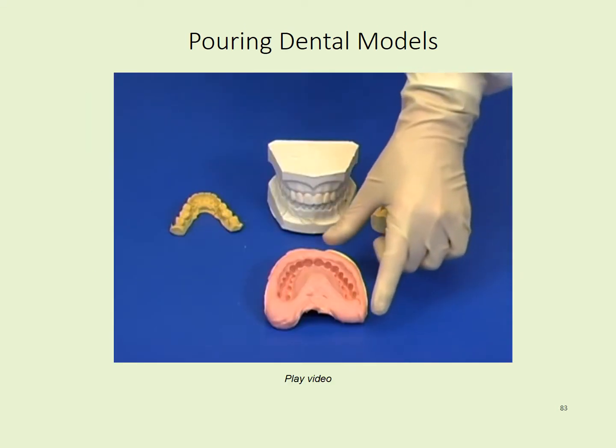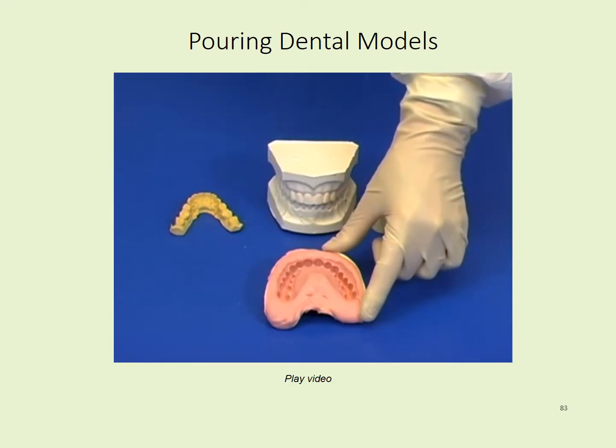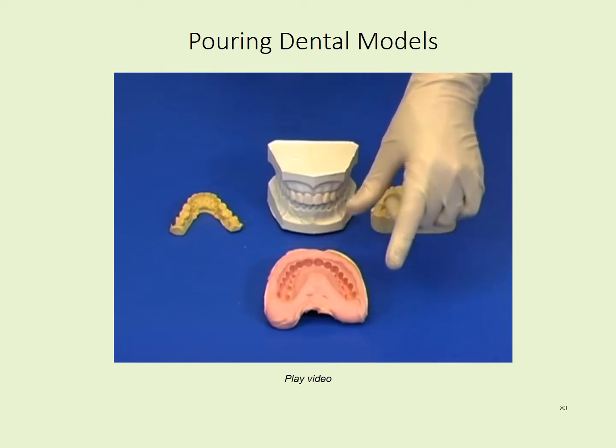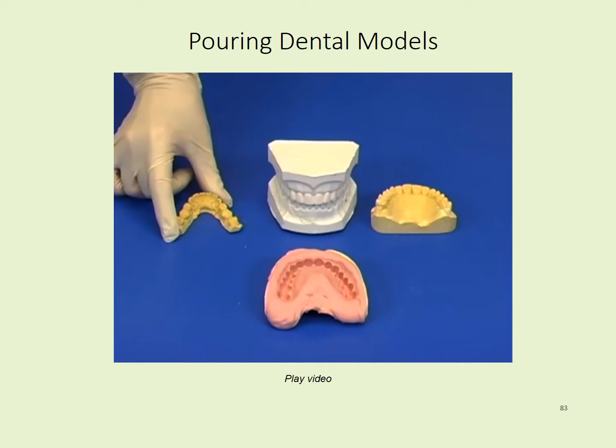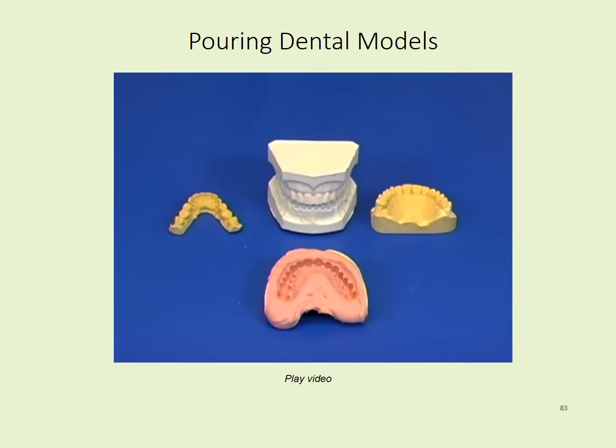The alginate impression is a negative replica of the patient's dentition. The impression must be poured up with a durable product to create a positive replica. We use dental stone or plaster to make a model that can be used for study models or lab work. I will demonstrate mixing dental stone and pouring a maxillary and mandibular impression without a stone base. These models can then be used to make bleaching trays or athletic mouthguards.